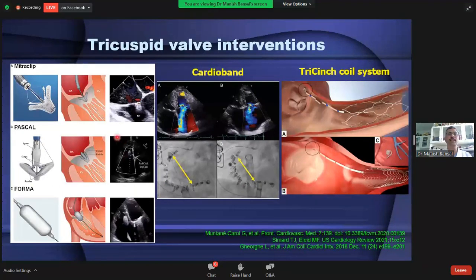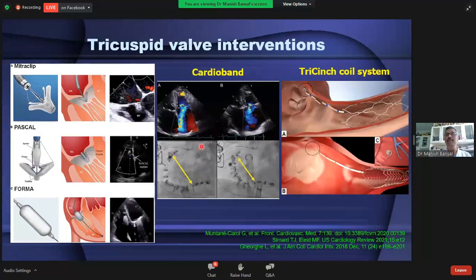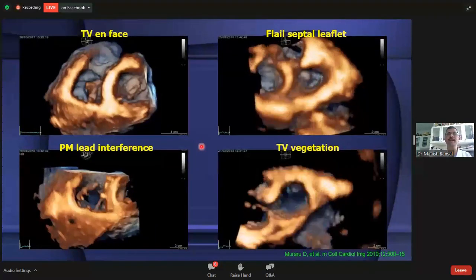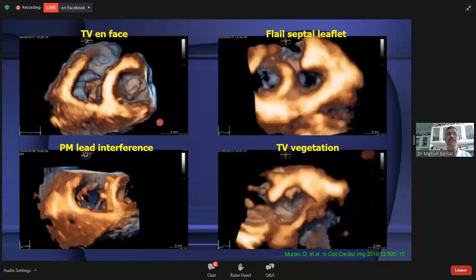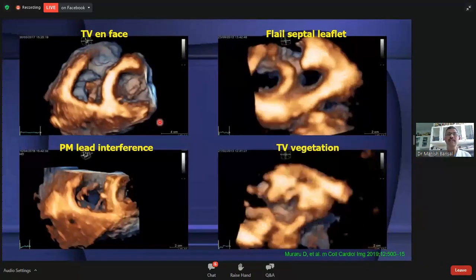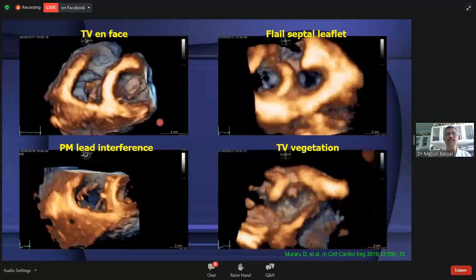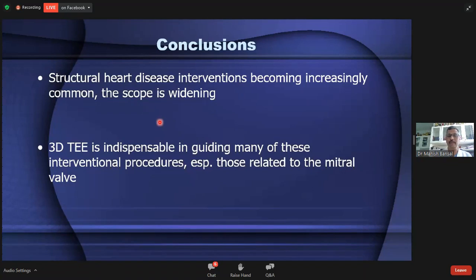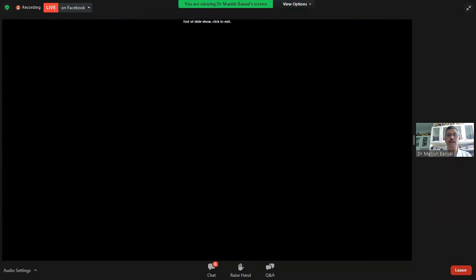Apart from the mitral valve, there are also many interventions being developed for the tricuspid valve, including a clip similar to MitraClip. All of these again require echo guidance — particularly 3D TEE — which is very helpful in defining the anatomy, leaflets, device position, and location. In summary, structural heart disease interventions are becoming increasingly common and the scope is widening because of ongoing advancements in technology. 3D TEE is indispensable in guiding many of these interventional procedures, especially those related to the mitral valve and now the tricuspid valve as well.